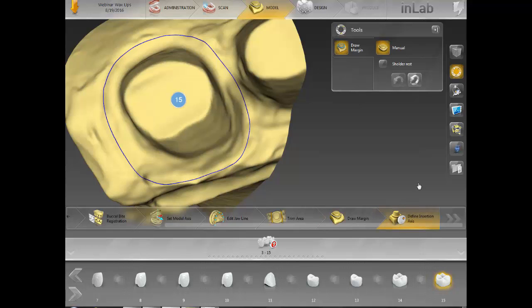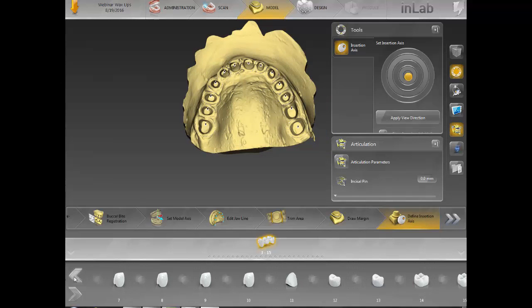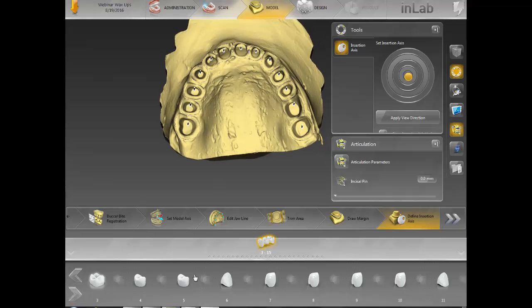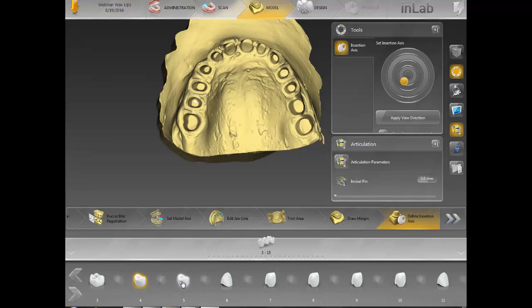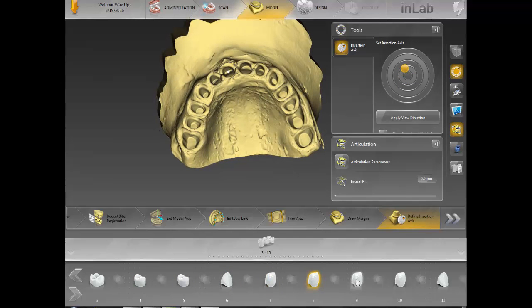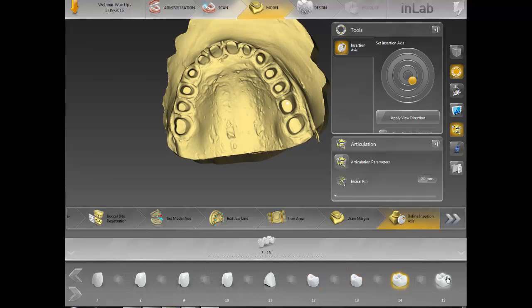Now we go to Edit Insertion Axis. On all the cases I do — bridges and such — this is the protocol I normally use. You look for some red when it comes to your arch. Now they're all connected, so I'll go to the bottom and click on every single tooth. The reason I do that is because once I click on it, it sets each axis for each prep tooth. No matter what, this is what I do on every single case — my fits are really, really nice, especially when working on big cases like this.